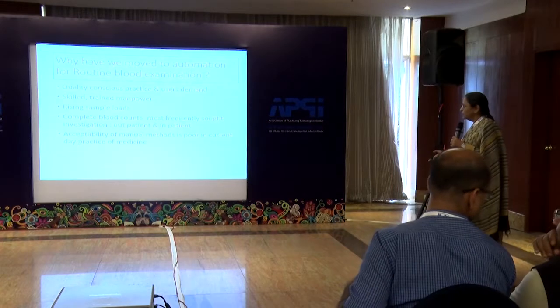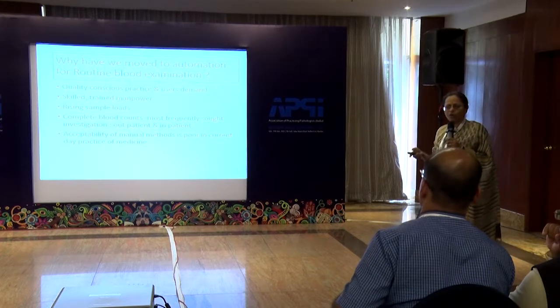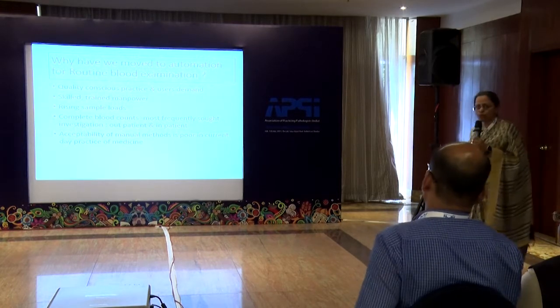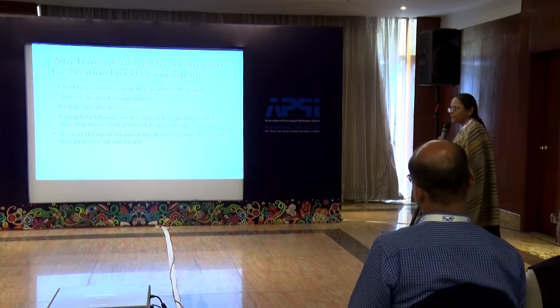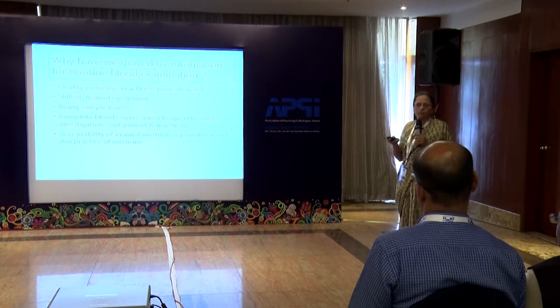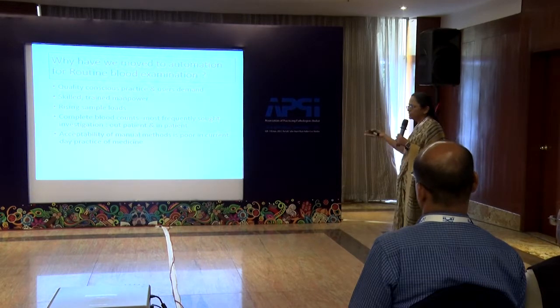See, firstly, why did we move on to automation? Why did we not stay with our traditional, conventional methods? Some of us were forced, way back in the 1980s, to move from manual to automation a bit reluctantly. Why? Because it was an unknown ocean. We didn't know what automation meant at all, definitely not in hematology. So some of us moved because we wanted to be a bit adventurous, and some of us moved because of other reasons.